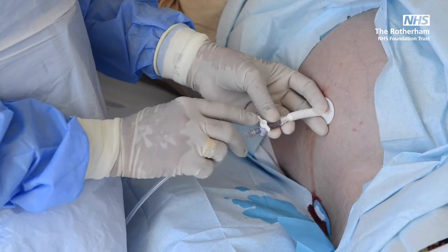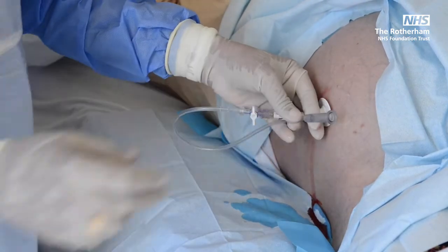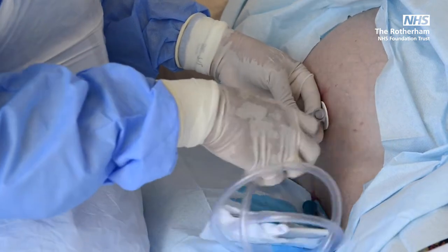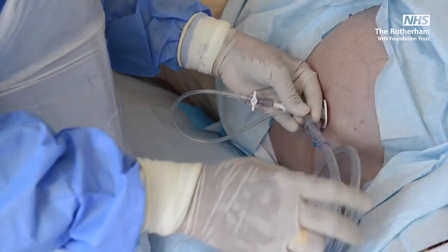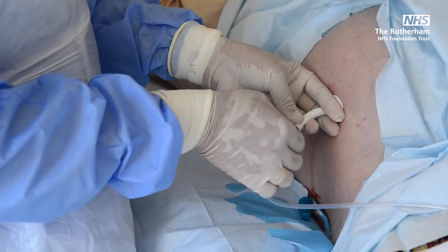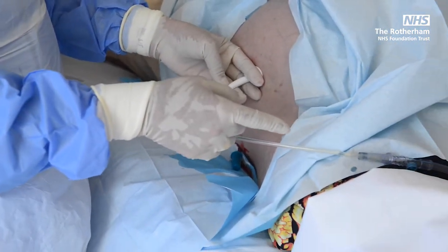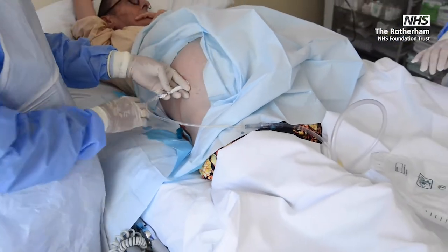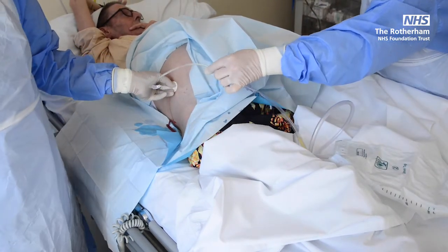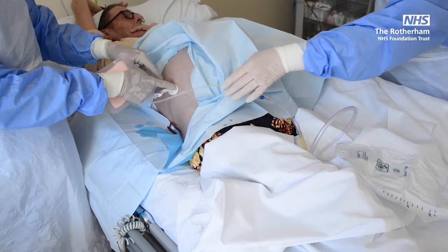As I said to you earlier, it is locked so that I am not flooded with ascitic fluid. Then I connect onto the catheter bag, and put it onto the side of the bed, and I'll open the drain now. So I can see all the ascitic fluid coming out. Now I have to make sure that I fix this drain onto the skin. So first of all, can I ask Diane to come over here to hold it for me, please?